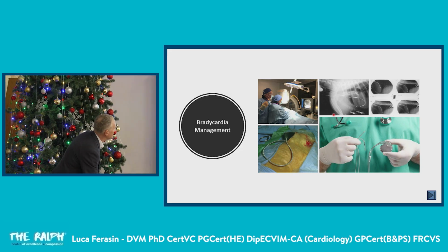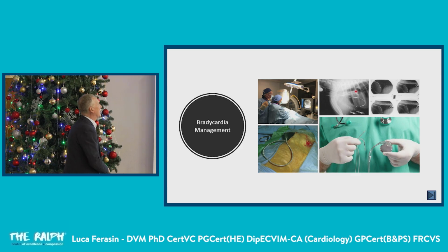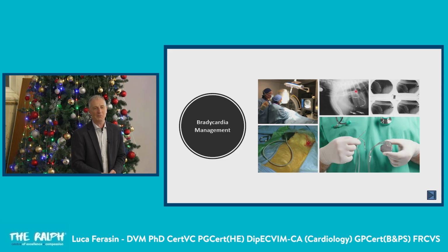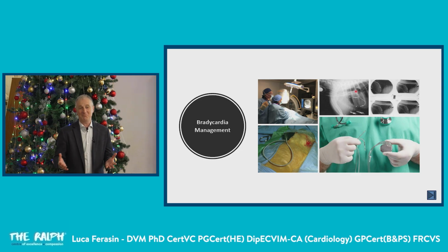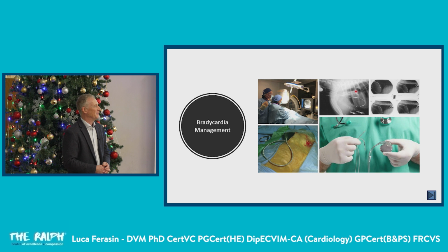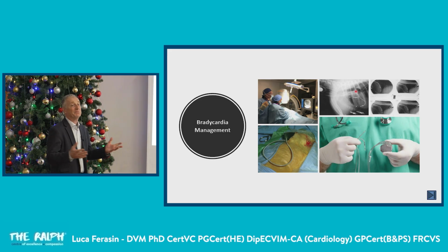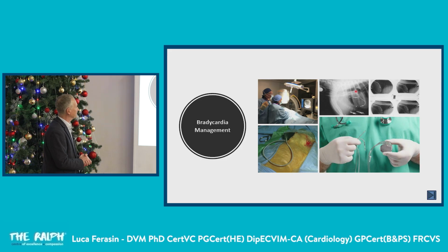This is the very first pacemaker I implanted 25, 30 years ago. There we go. And so you see, these are also much cheaper nowadays. At that time, we were using recycled pacemakers donated from funeral directors. And nowadays, they are much, much cheaper, and we only use brand new pacemakers. We tried to re-sterilize them, but they're all still there in the box. We never use the re-sterilized ones. But if somebody says, oh, I don't have enough money, then perhaps we can offer them.